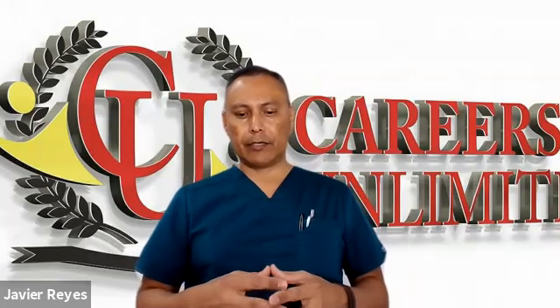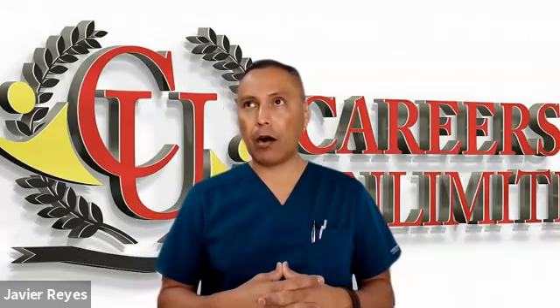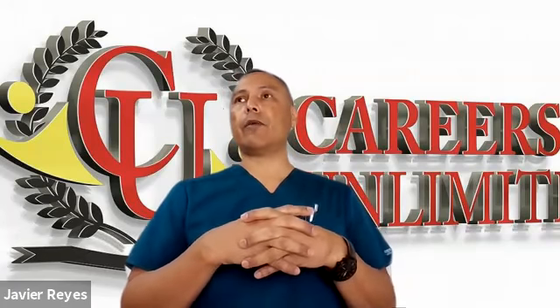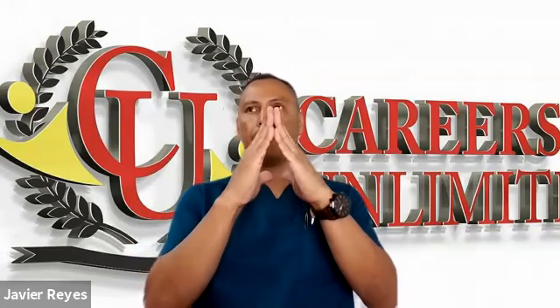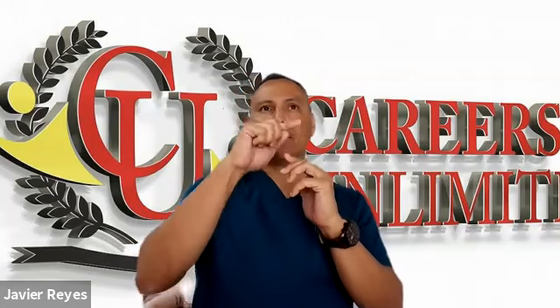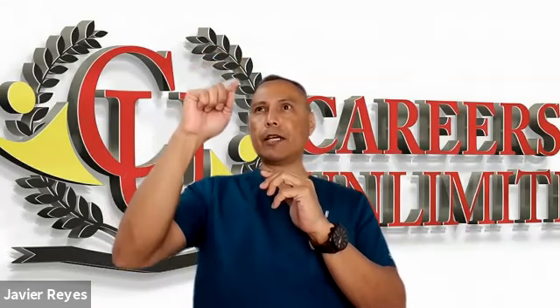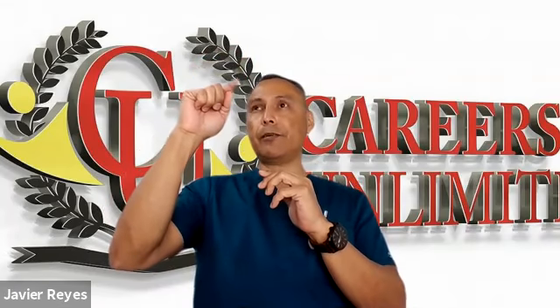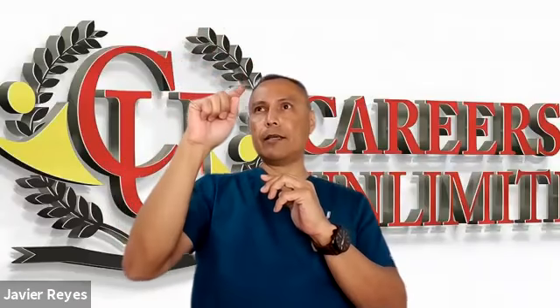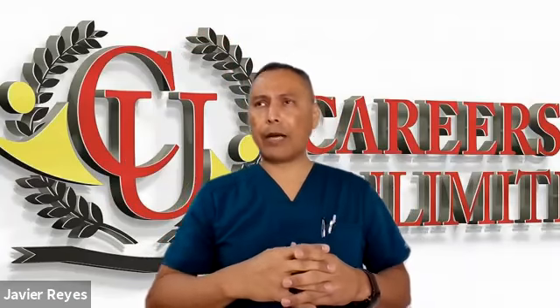The result of this change in direction is the classic RSR pattern. RSR. What it means is that you're going to see a notch in your R wave. Instead of being a nice pyramid-looking or pine-looking R wave, you're going to see an R, which means you're going to have a little peak, and then you have a little notch down like this. That's going to be your S, and then it goes back up. That's another R. So you have R, S, R. Okay, that's what it means in the right bundle branch.